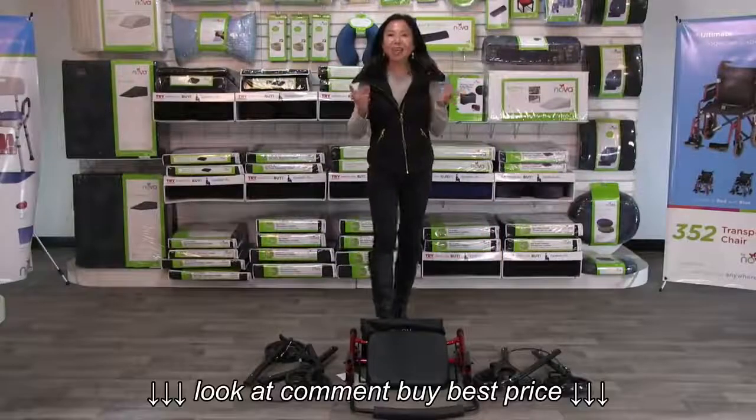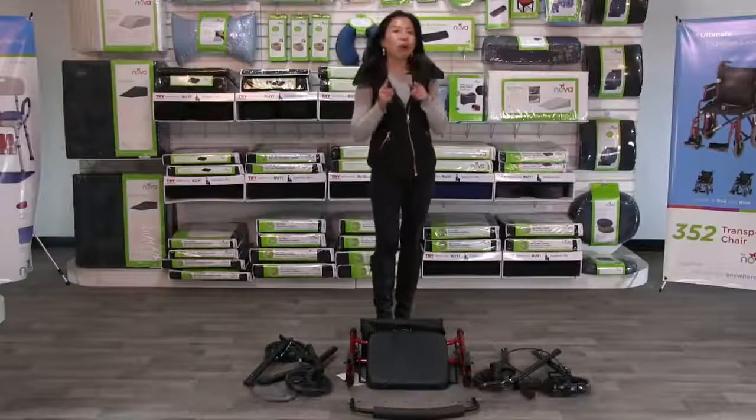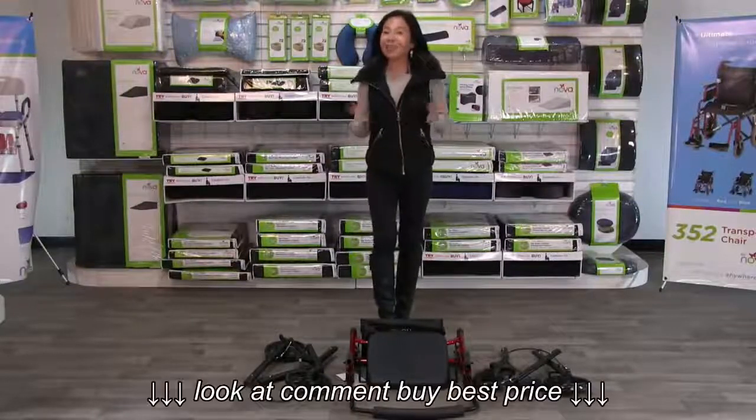Hi, I'm Sue with Nova, and in this quick video I'm going to show you how to put together your Star 8 rolling walker and how to use it.